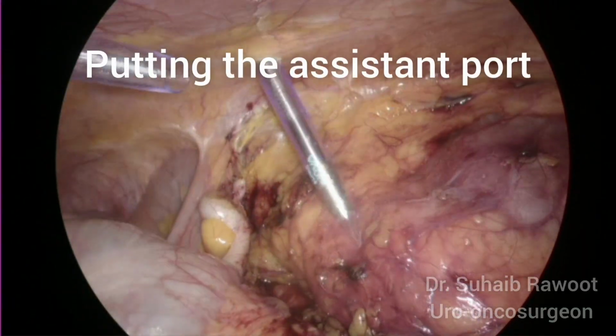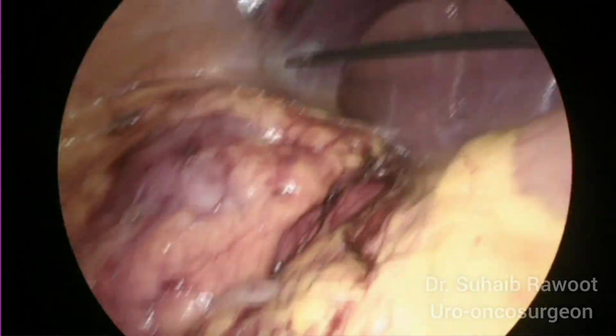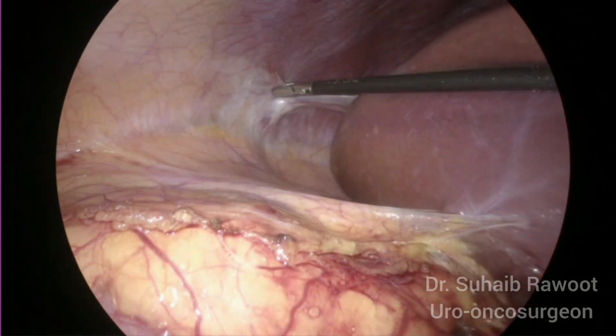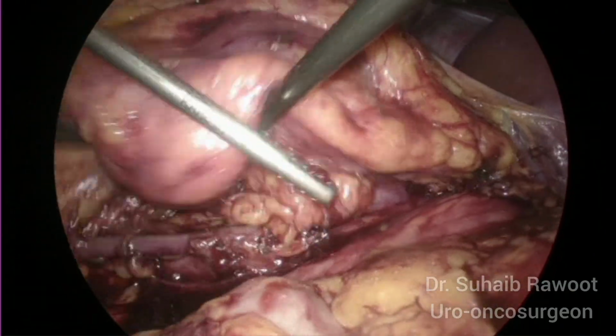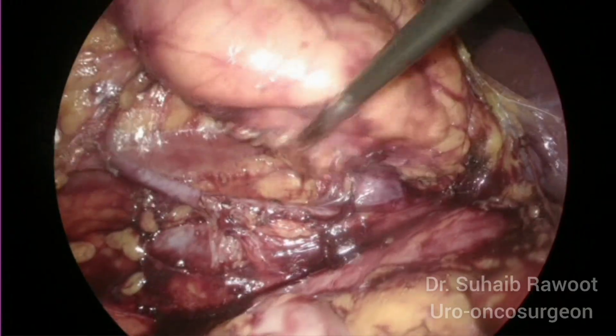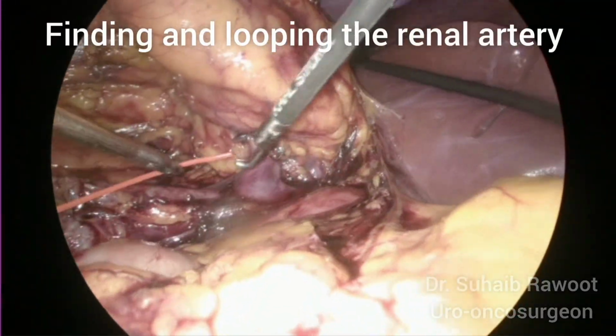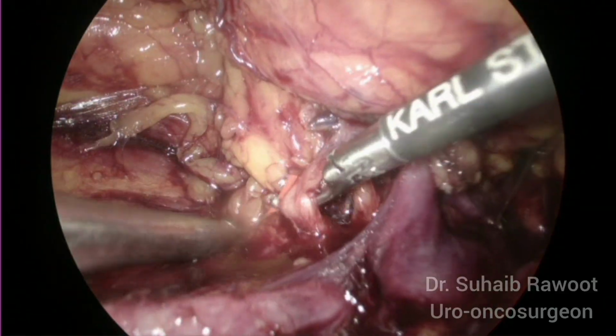Now we are putting one assistant port to lift the kidney up so that both of my working hands are free and I can easily dissect the hilum. So we have dissected the hilum and we have found that two renal arteries are there.